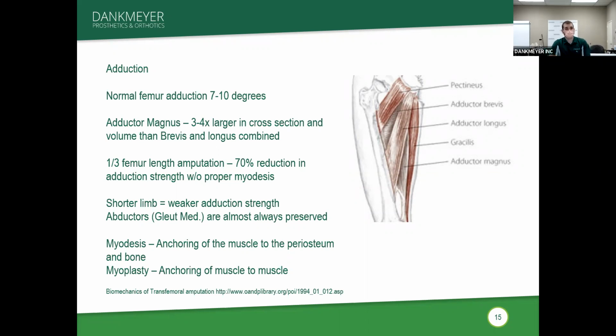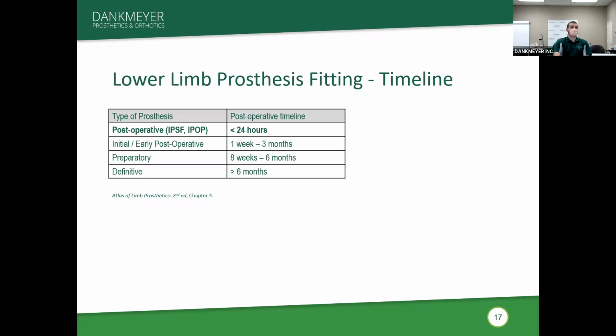And again, whenever we're fabricating a prosthesis, the whole battle in the transfemoral game is to try to present as much of a natural alignment as possible. We'll get into the specifics of how we do that a little bit later.